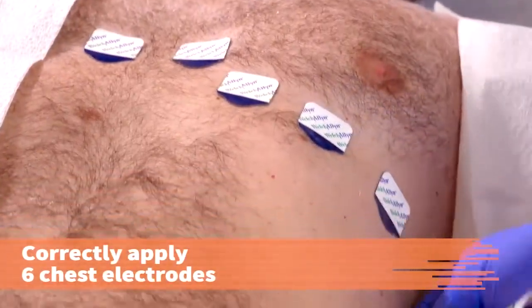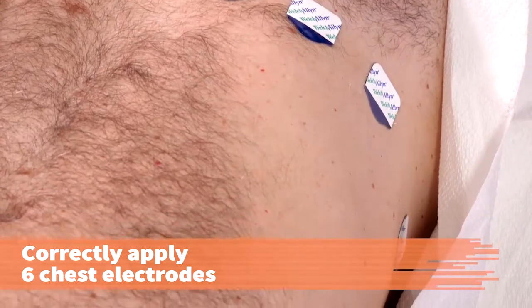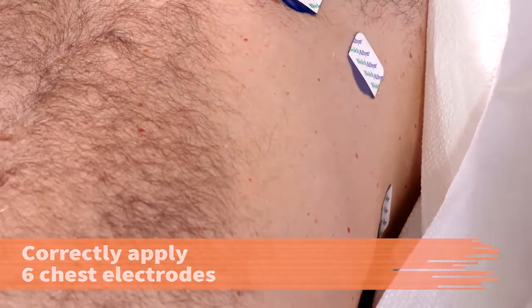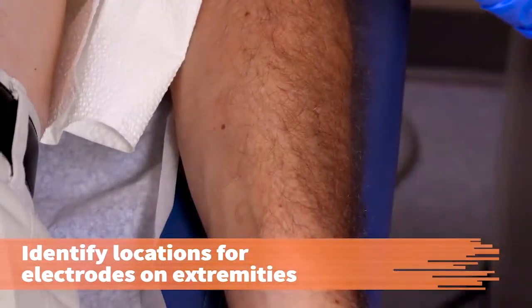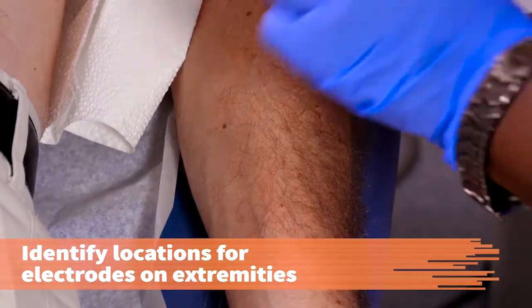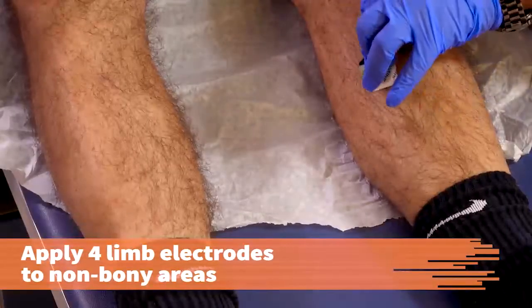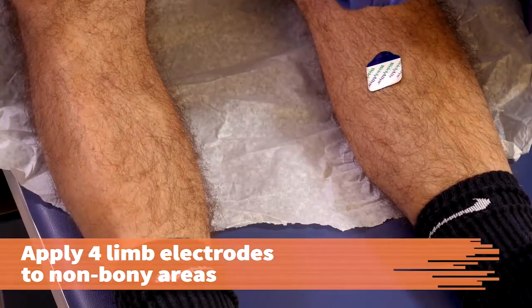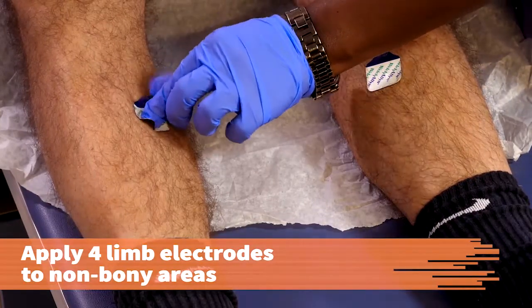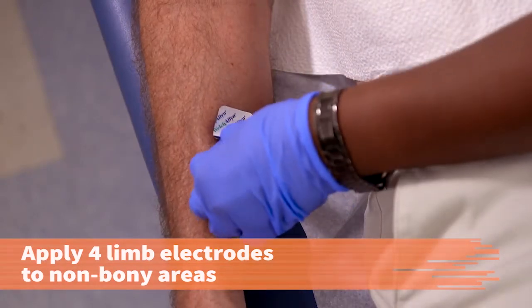Correctly apply the six chest electrodes. If you are using tab electrodes, tabs should be pointed to the waist. Identify the locations for the electrodes on the patient's extremities. Refer to the operating manual for positioning the arm electrodes if needed. Apply the four limb electrodes to non-bony areas. If using tab electrodes, the lower leg tabs should point to the waist, and the arm and wrist tabs should be pointed down.